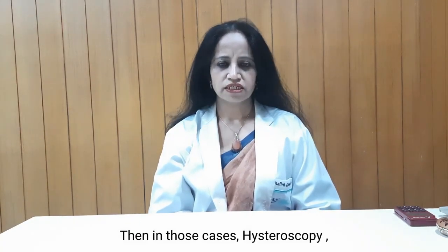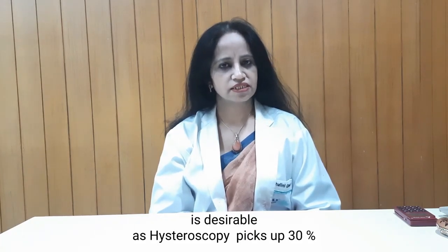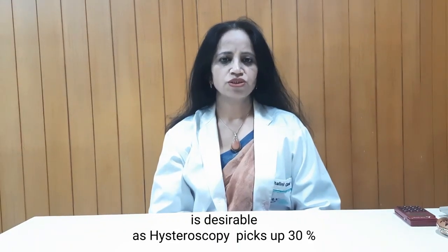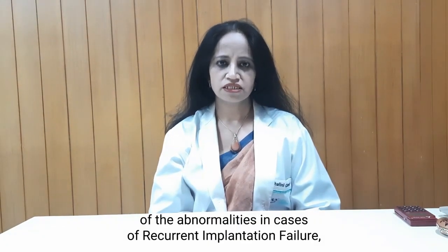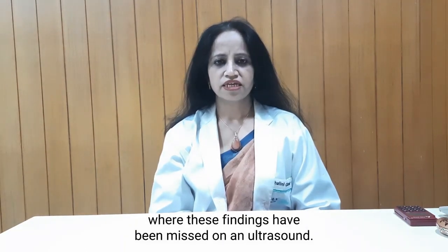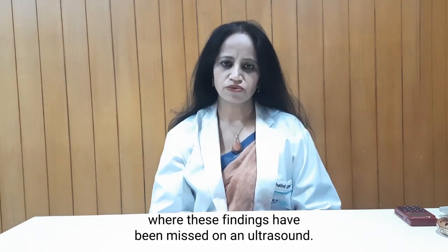Then in those cases, hysteroscopy is desirable as hysteroscopy picks up 30% of the abnormalities in cases of recurrent implantation failure where these findings have been missed on an ultrasound.